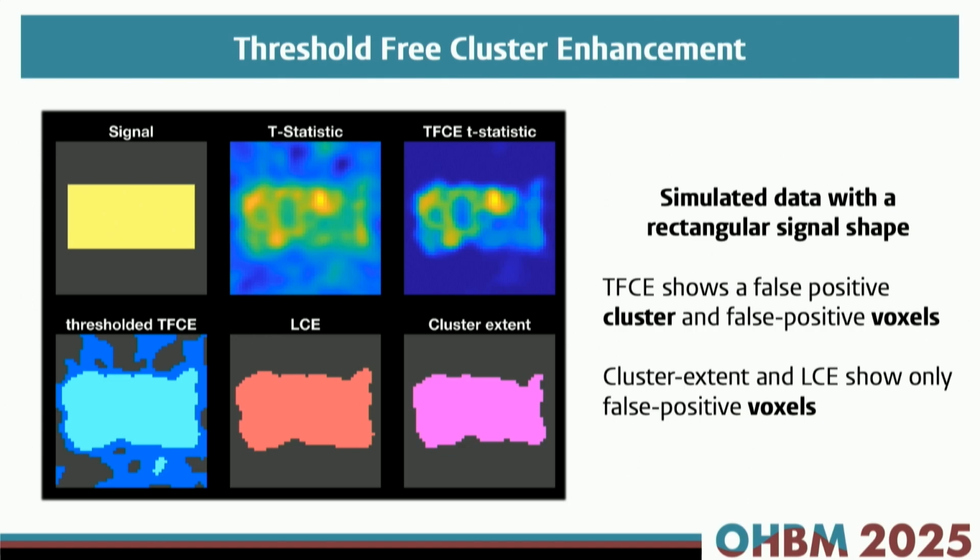This is the general thing that you see in TFCE data, is that the t-statistic is pretty much all over the place, and you see some blobs of activation. And what you see for the TFCE statistics is that the blobs that are really high get enhanced a bit, they get somewhat higher, and all these low things are suppressed in the data. So it enhances the clusters that you have, and it suppresses the smaller ones that don't have a lot of support. If you would threshold the TFCE statistic based on permutations, you would get an area like this, with the dark blue, again, the support.